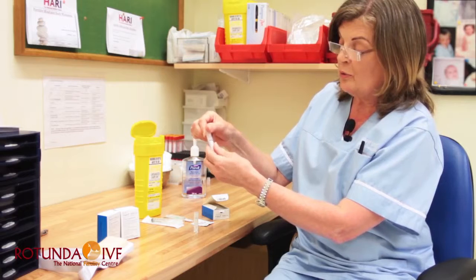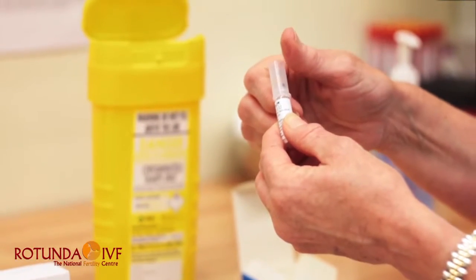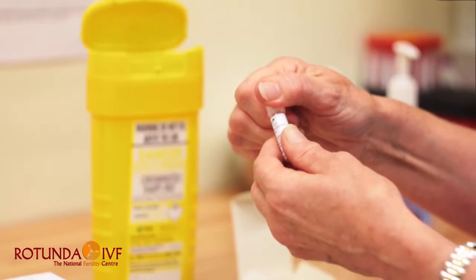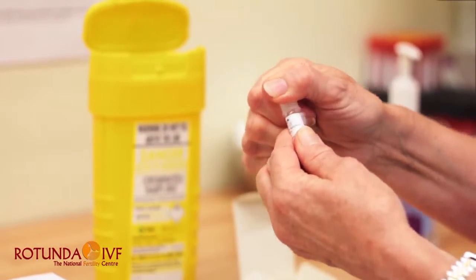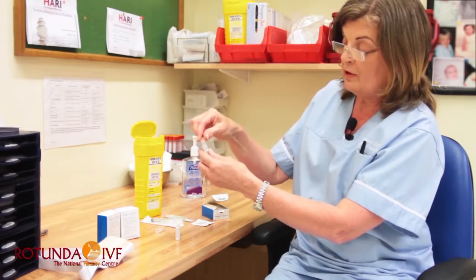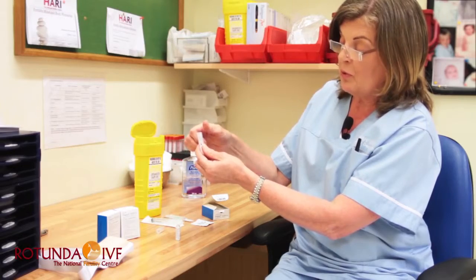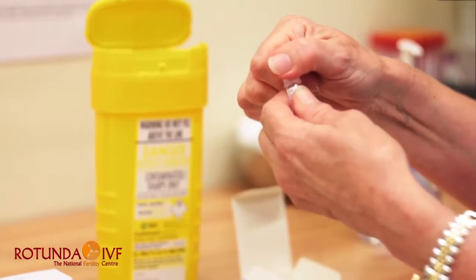Taking your powder now, hold the base in your left hand, and with your right thumb covering the black dot, snap it open with one steady movement. Take the vial of fluid also, hold the base of it in your left hand, and with your right thumb cover the black dot.